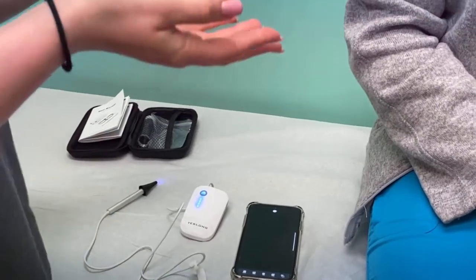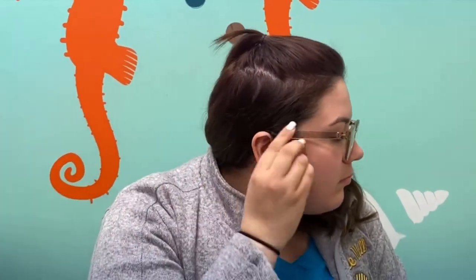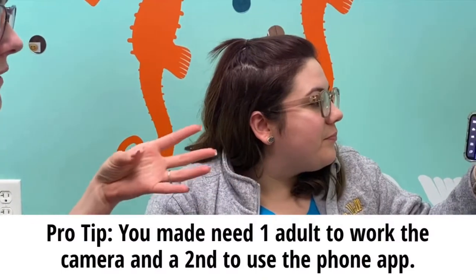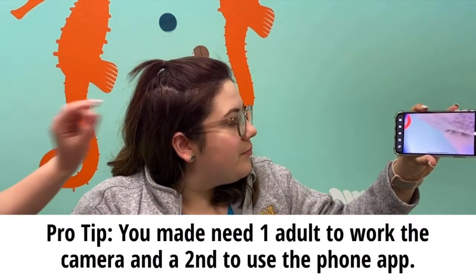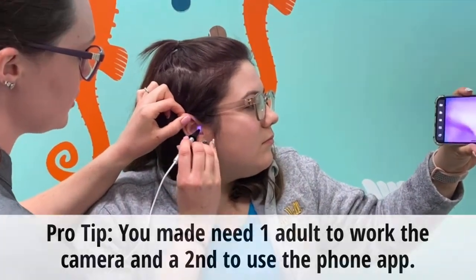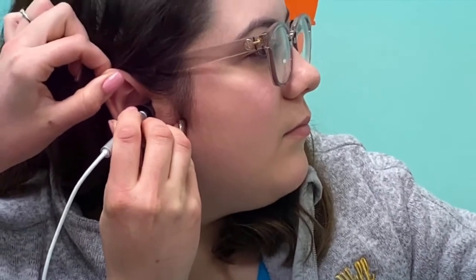And then we're going to get our patient ready. Samantha, go ahead and just turn your body a little bit for me and look that way. We're going to move her hair out of the way. Sam's going to hold the phone up for me just so that I can see what's going on while I'm entering the ear. I'm going to go ahead and tug on this ear just a little bit to open up the canal and we're going to start to go in.